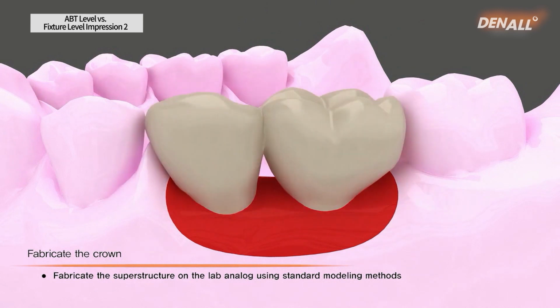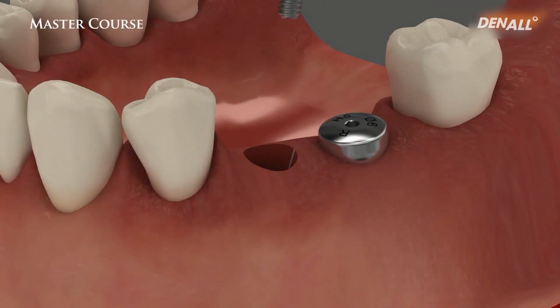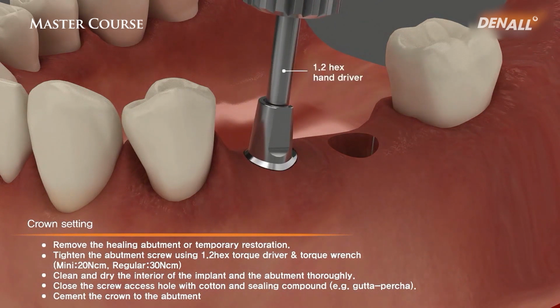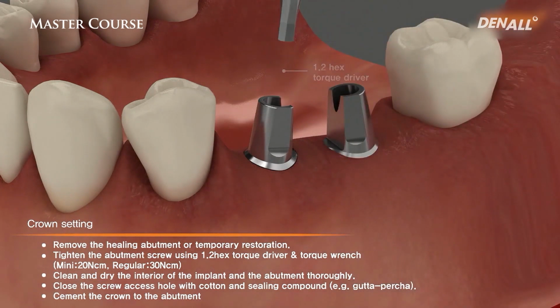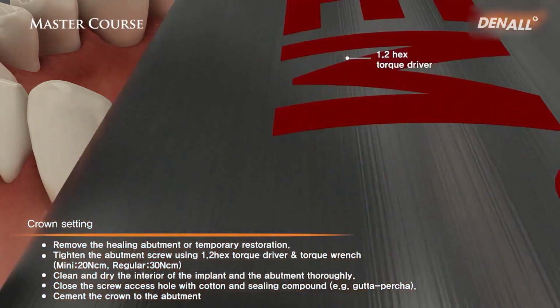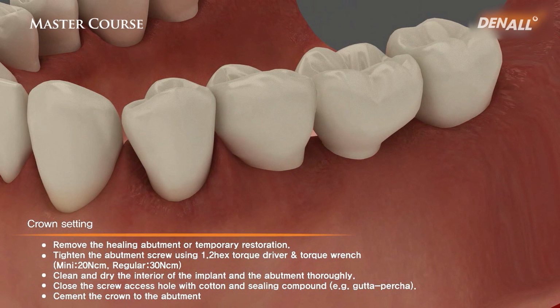In the lab, once the crown is fabricated, then it comes to the clinic. And healing abutment is unscrewed again, and then abutment using hex. The positioning is set and delivered and connected correctly. Then the positioning created in the lab is used for the positioning in the clinic to go in the right place, and with the cleaning everything will be complete. 3D positioning, how the impression coping is used for taking impressions. I hope that through this video you have gained more understanding.